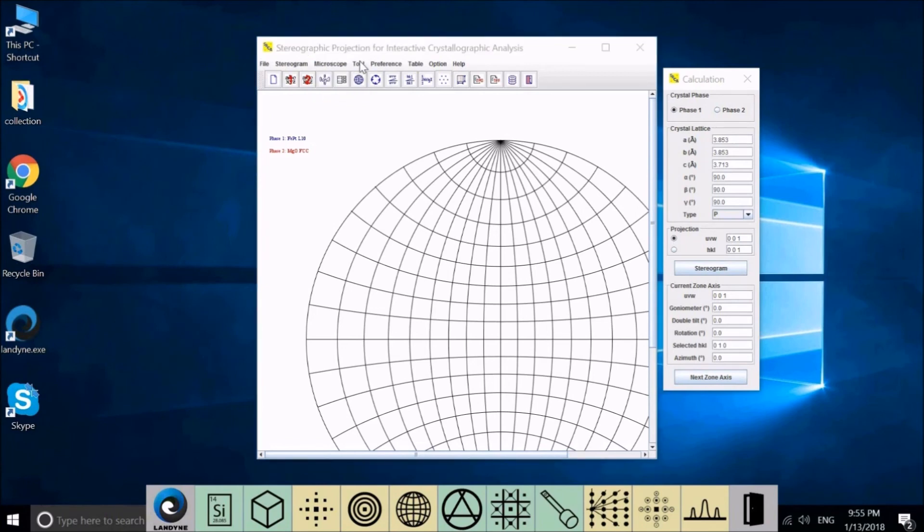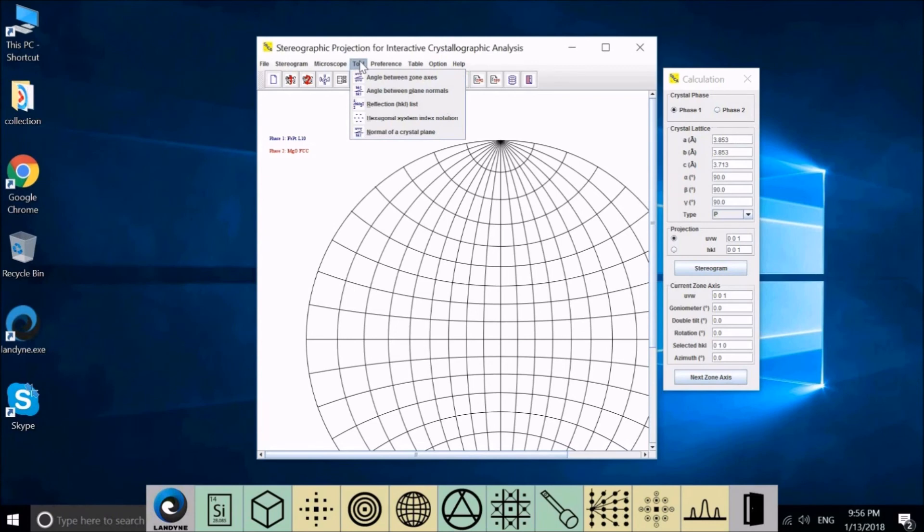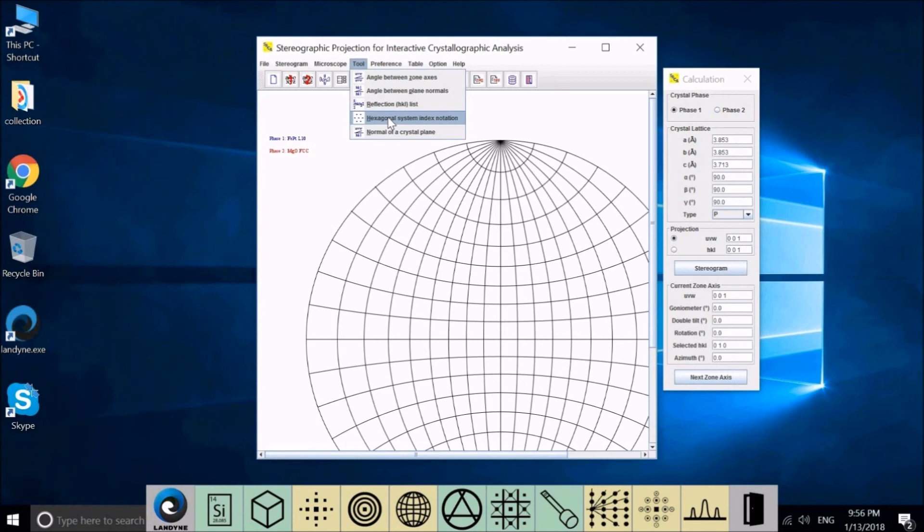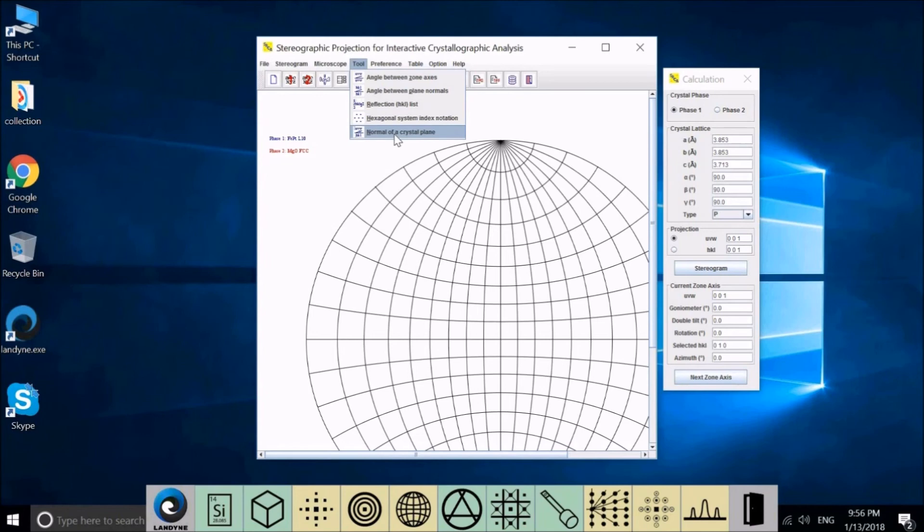In Tool, we provide different kinds of calculations. For example, angle between zone axis, angle between plane normal, reflection HKL list, the conversion of Miller-Bravais indices for hexagonal system, and also calculate the normal of a crystal plane.